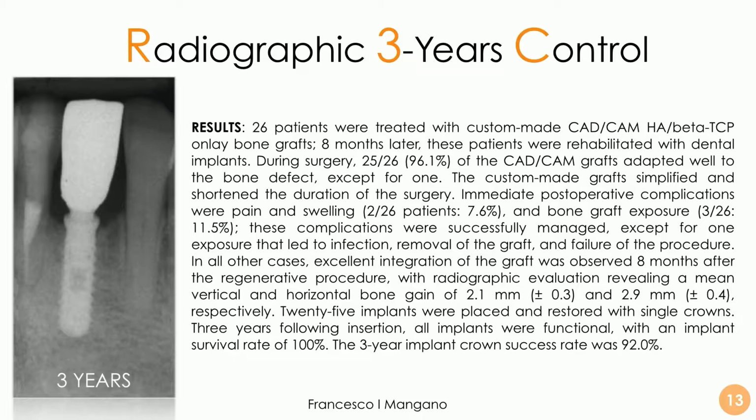After all, in all other cases, we had an excellent integration of the graft, observed and confirmed 8 months after the regenerative procedure and 3 years after the implant had been placed. So 100% success of the implants placed, we are talking about 25 implants placed, and with a very high implant crown success with a low rate of biological and functional complication.